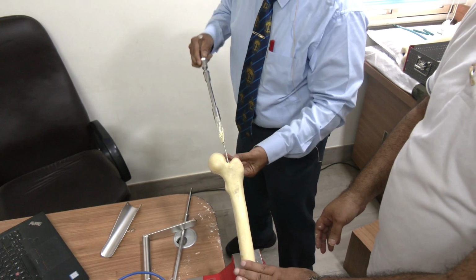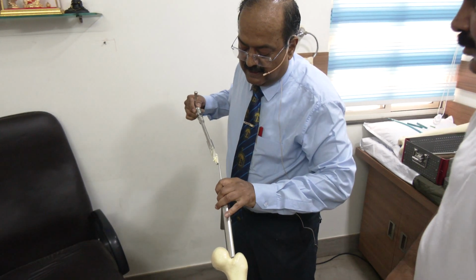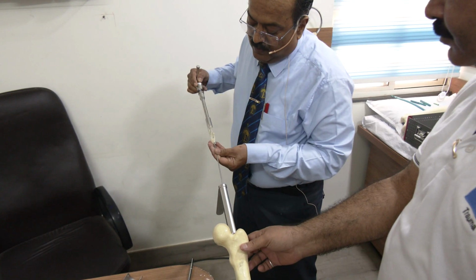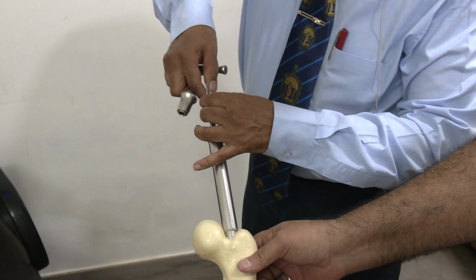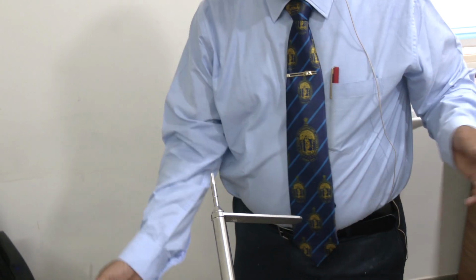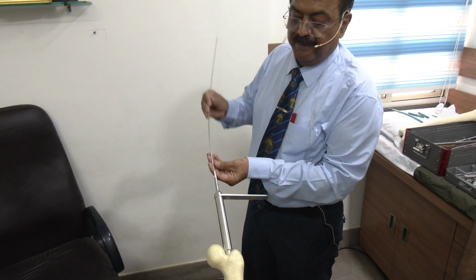So what I have done now is, I have passed this instrument through the protector sleeve, and once I have passed it, I take this out and take out the guide pin, and immediately insert a little more flexible, longer wire.